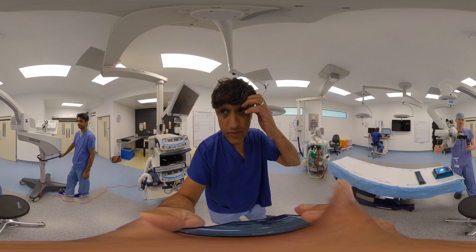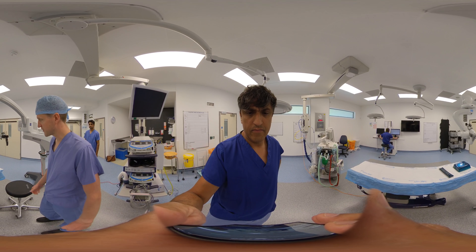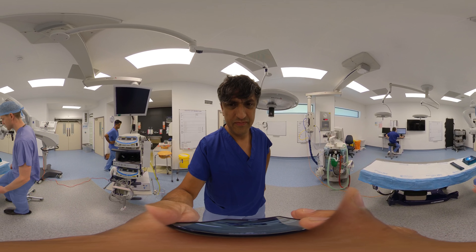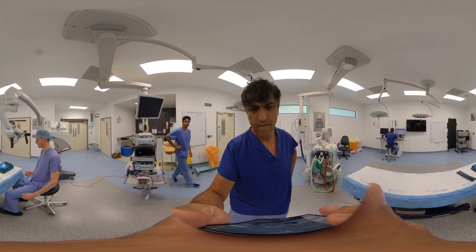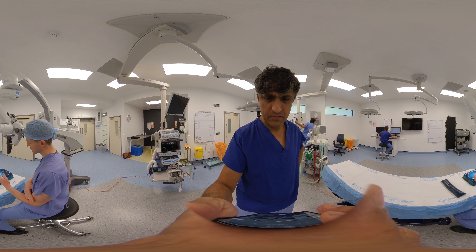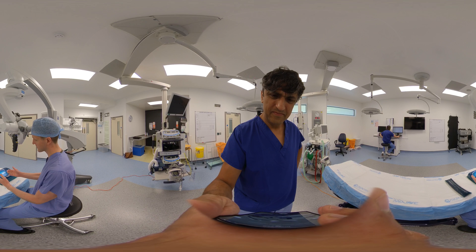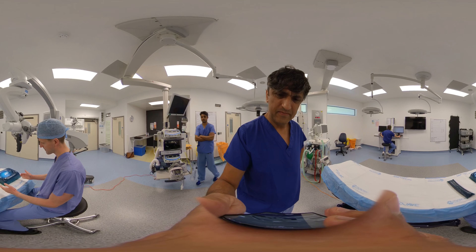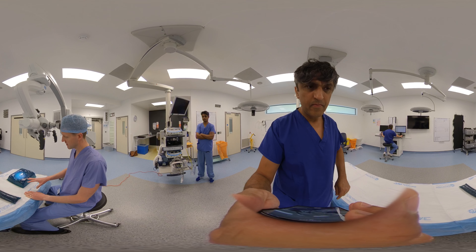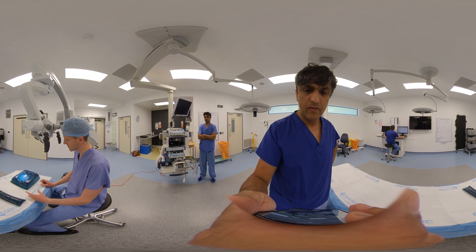When setting up the microscope, begin by getting the table to a comfortable height. I personally prefer the table fairly low, aiming for a position where you can adjust your shoulders so that your arms are elbows in at the side, elbows bent to 90 degrees, and your operating field is flat at that position. You can put some gauze, gown packs, or a kidney dish here to create a stable base to rest the side of your hands, giving you the best chance of minimising tremor.